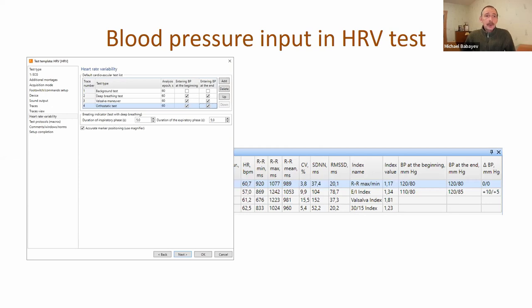Now it's possible to input blood pressure in the heart rate variability test. We have a few checkboxes that can be set individually for each test type - at the start of the test and at the end of the test. If this checkbox is checked, you will see a request for blood pressure, you measure and input these values, and after that you will see them in the analysis window.